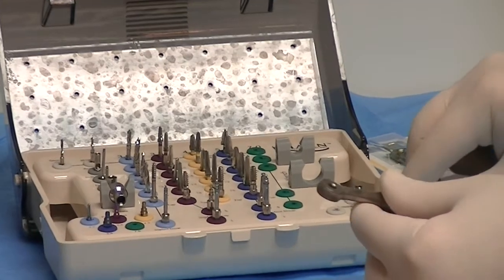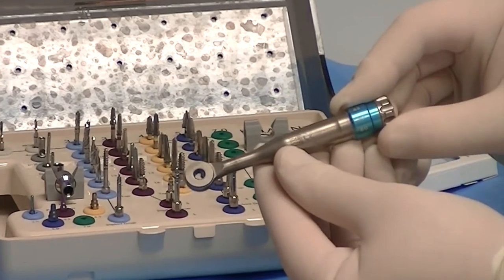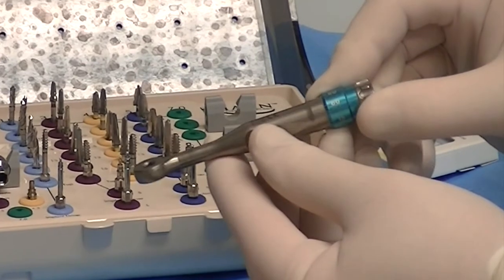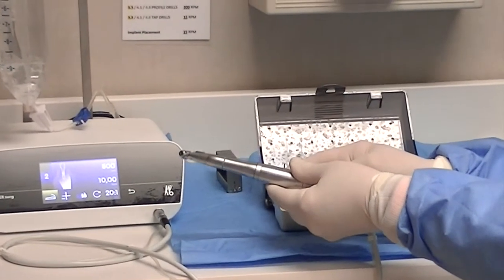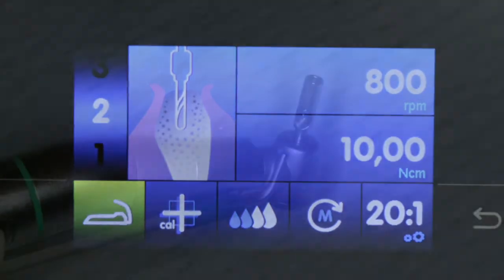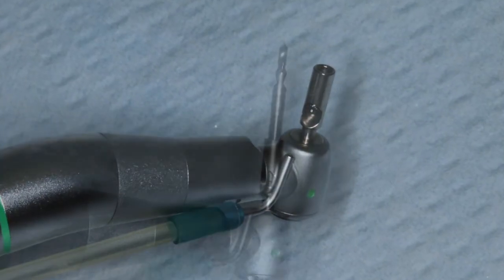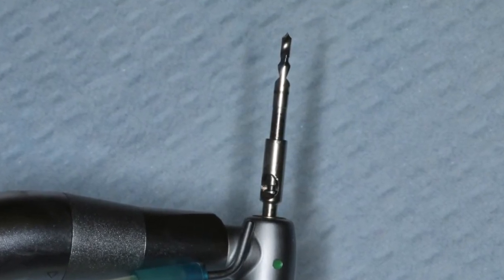We have a single-handle torque wrench which will measure the amount of torque that we will use in a certain situation. Here we're using a handpiece — in this system we're going to drill at 800 RPMs at 10 Ncm. Here's a drill extension that will allow us to make our initial penetration using a 2.4 diameter burr.